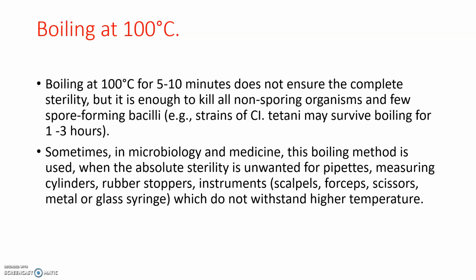For this type of materials, we can use the method of boiling. Because scalpels and glass syringes do not withstand higher temperature, this method is usually recommended.